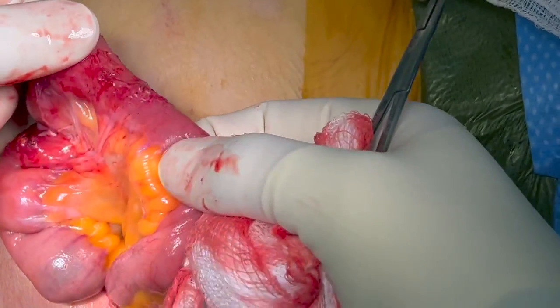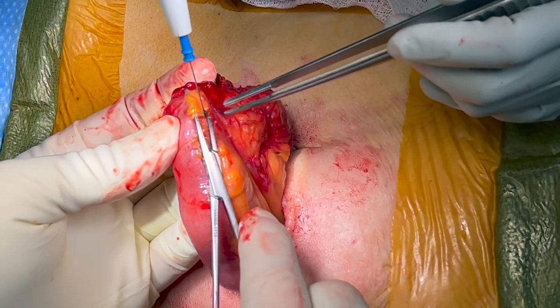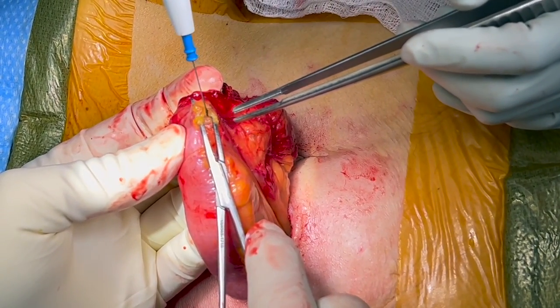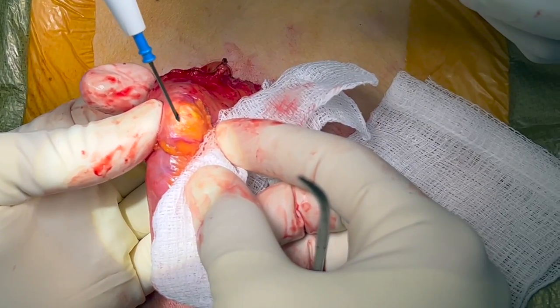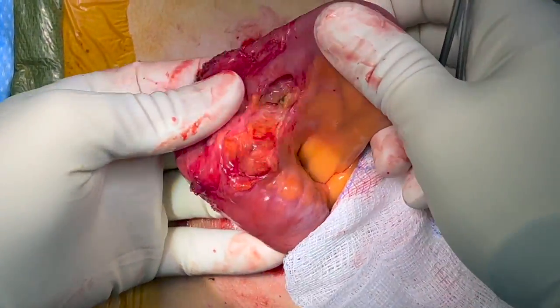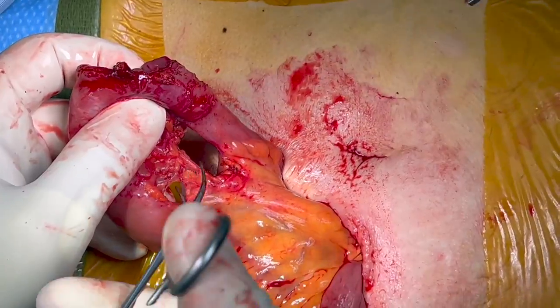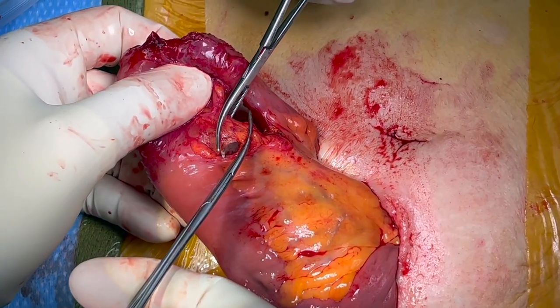In this case, we chose to resect the old ileostomy site and create a stapled side-to-side functional end-to-end anastomosis. Mesenteric windows are created at the proximal afferent and distal efferent ileal limbs. The mesentery is divided between hemostatic clamps and tied with 2-0 absorbable sutures.